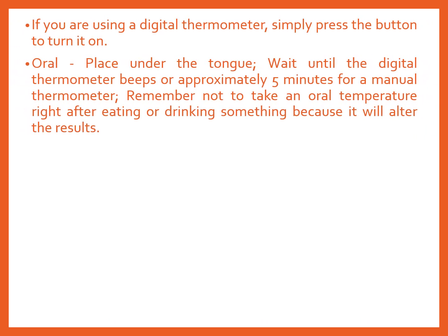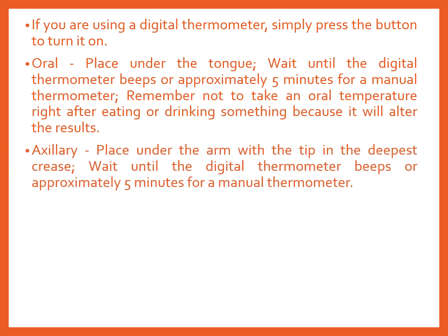So if you're using a digital thermometer, simply press the button to turn it on. For oral, place it under the tongue. Wait until the digital thermometer beeps, or approximately 5 minutes for a manual thermometer. Remember not to take an oral temperature right after eating or drinking something, because it will alter the results.